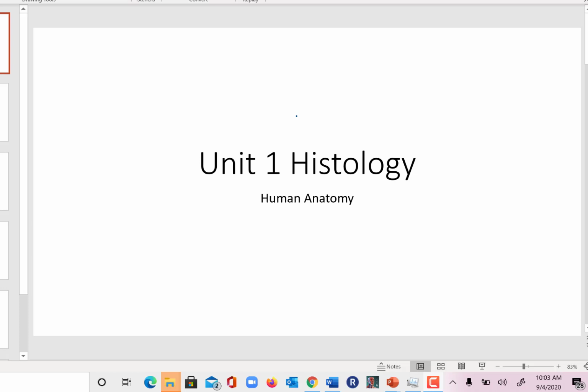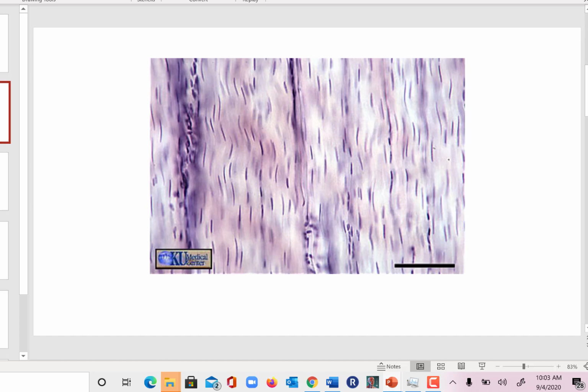Hello class. This video is to address our Unit 1 Histology. There are only a few slides of histological specimens that you are responsible for in Lab Unit 1. Again, these are all fair game and can be tested on your first lab exam.